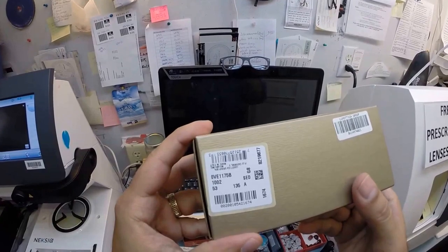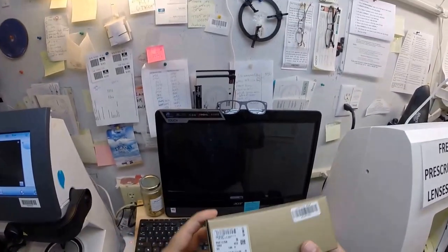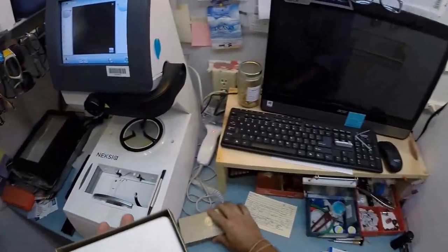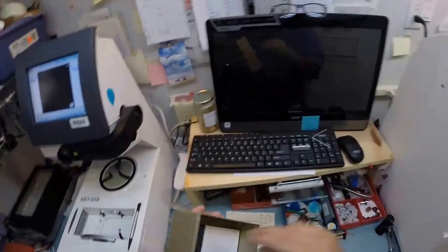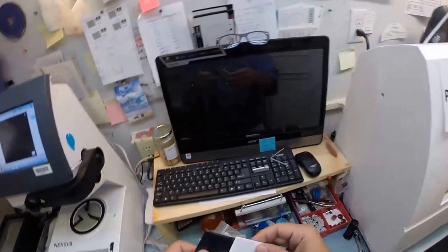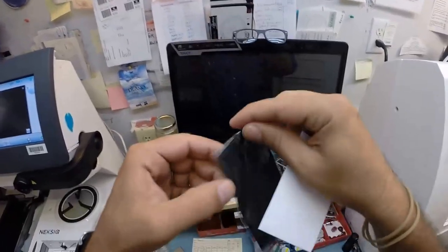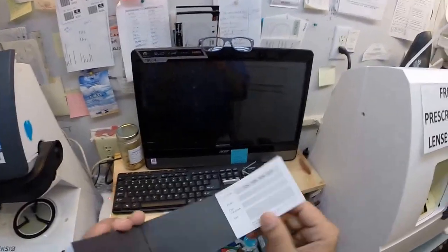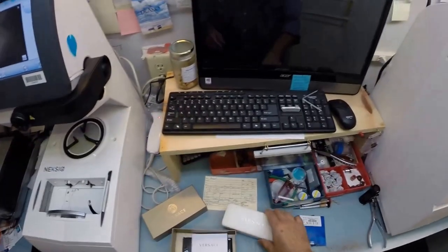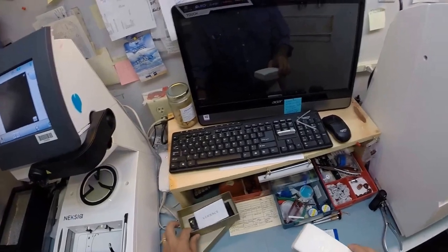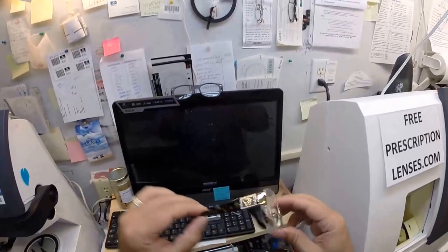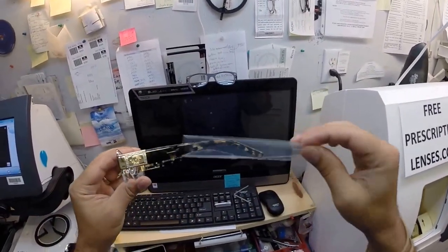In fact, let's turn it over. It is the 1175 color 1002 in the 53 eye size. Let's go ahead and take everything out. This is the box that it comes in.